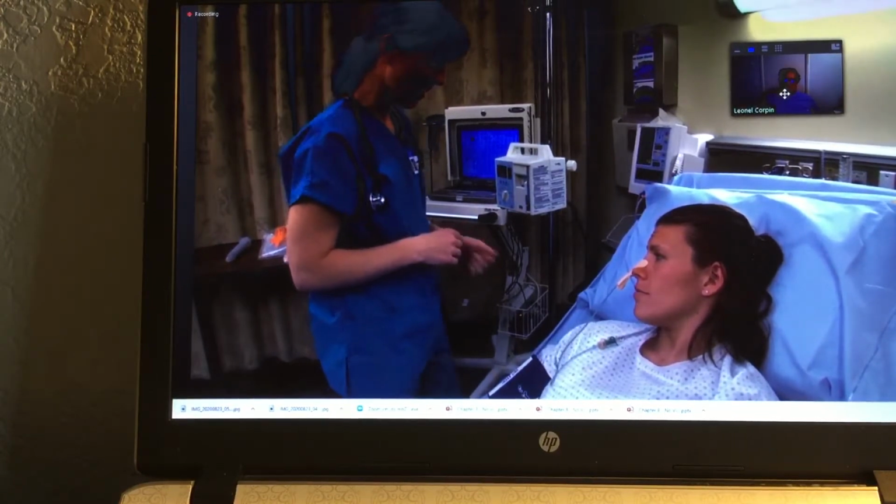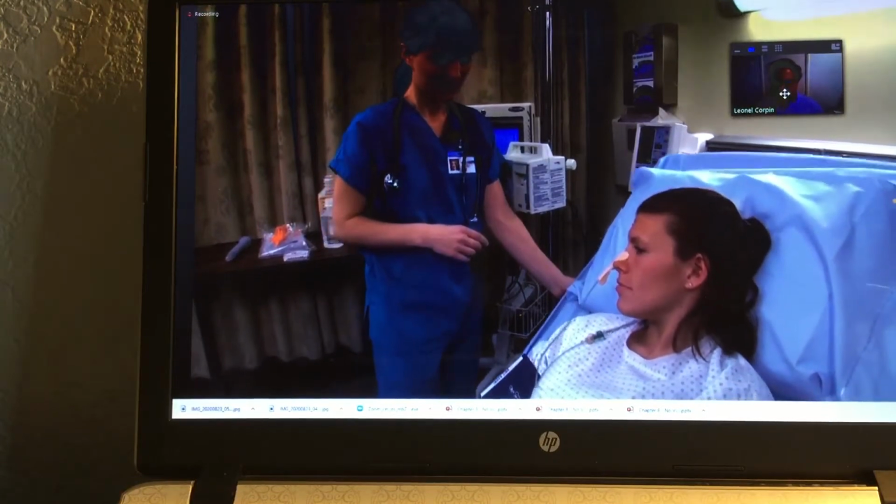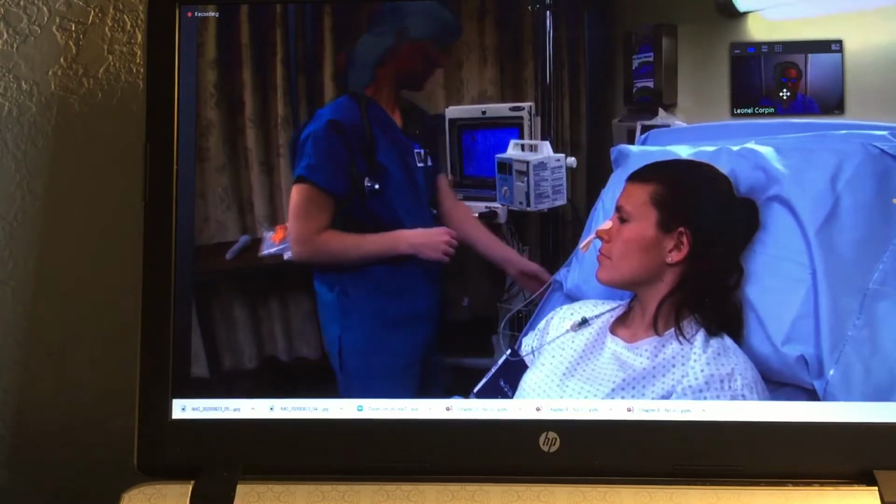If the provider prescribed intermittent feedings, assess your client's learning needs. Make sure she understands the intent of the feeding and any possible adverse reactions.